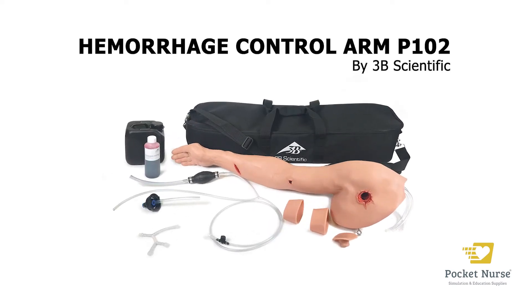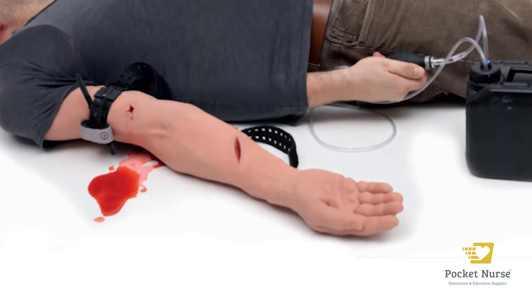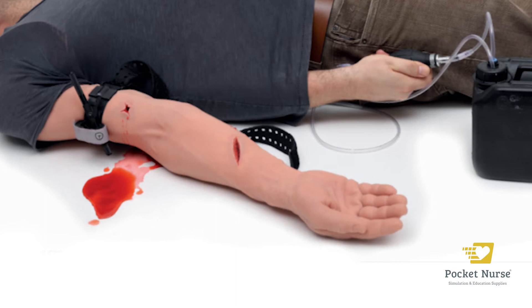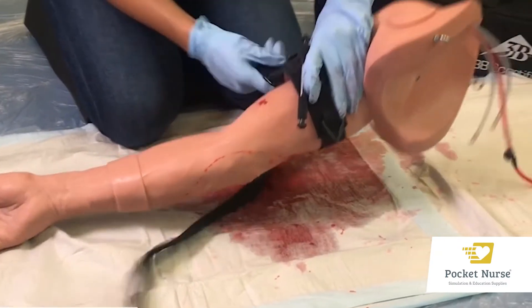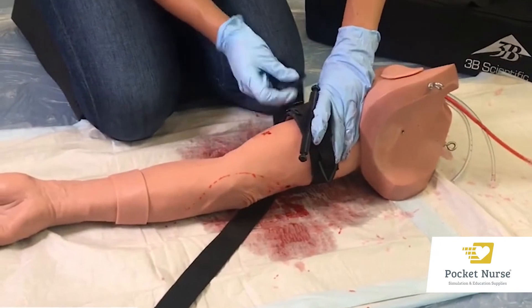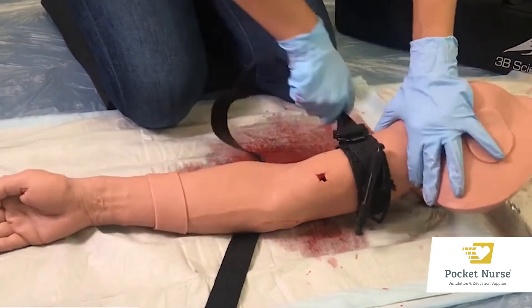Introducing the hemorrhage control arm trainer P102 from 3B Scientific. This versatile trainer is well-suited for teaching bleeding control and management of traumatic injuries to the arm. This simulator promotes improved pre-hospital patient care instruction through hands-on demonstration and practice of hemorrhage control with wound packing and tourniquet application.